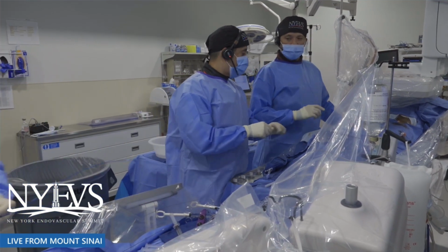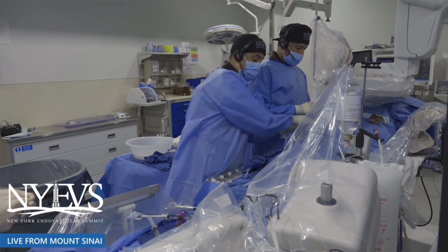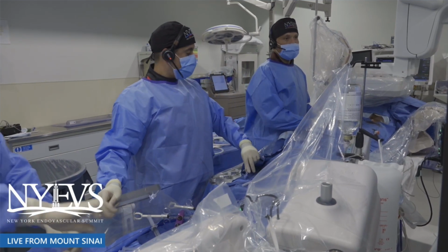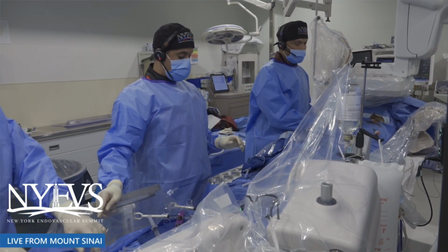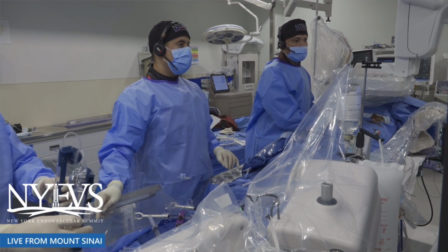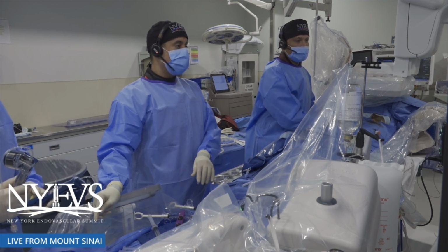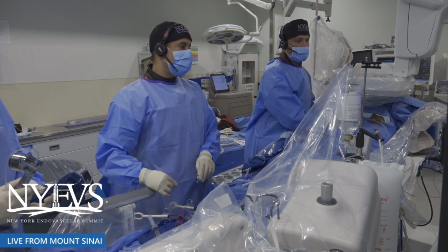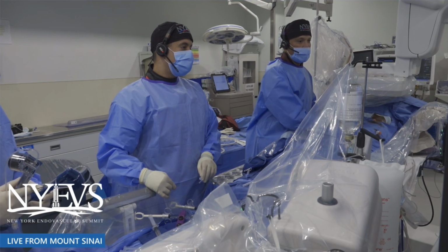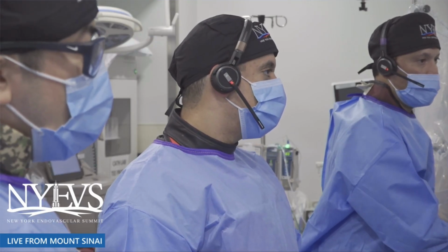I still think that it was lack of aggressiveness with the balloon expandable stents. That's why you showed the difference. That made the difference. So I want to make sure that with the balloon expandables I get adequate expansion. But I do think that you benefit, in terms of precision, and also being able to use the kissing technique, and also having that radial force with that eccentric calcified lesion, that you're going to get a better result with balloon expandable here.